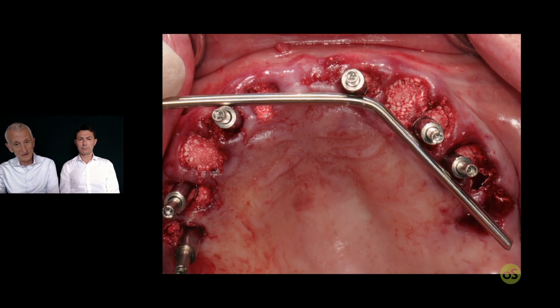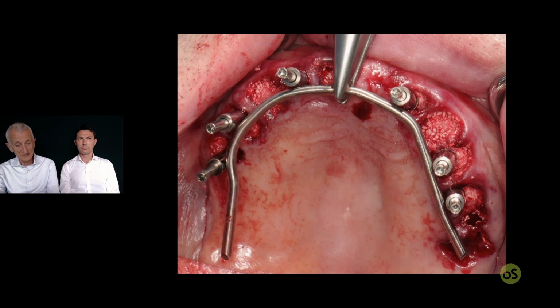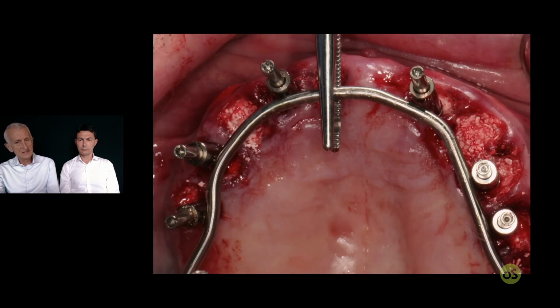So here is your wire, and you have done 1 bending and 2 bendings. So not so many steps. A couple of bendings with the dedicated clamps are enough to shape your arch and to get the contact with every abutment. Then it can be that on some abutment you are a little bit distant. Spend a little bit more time to shape the wire a little more until you are more or less in contact. Finally, you are ready for welding.